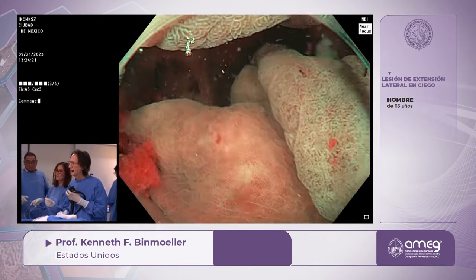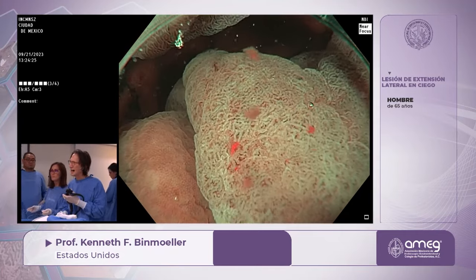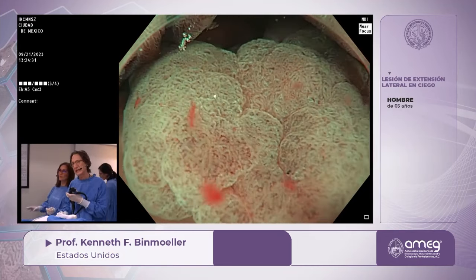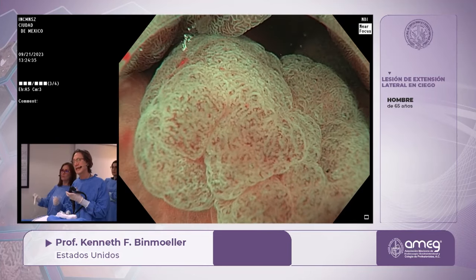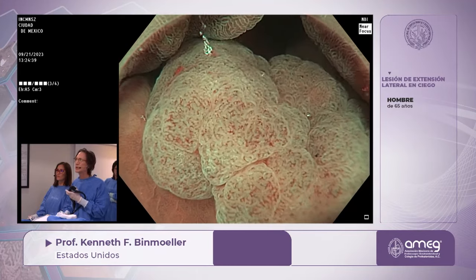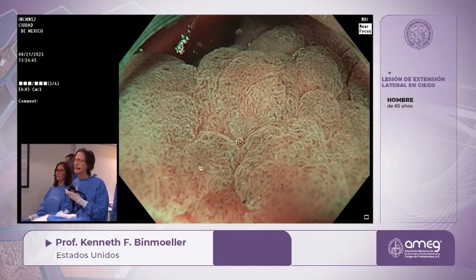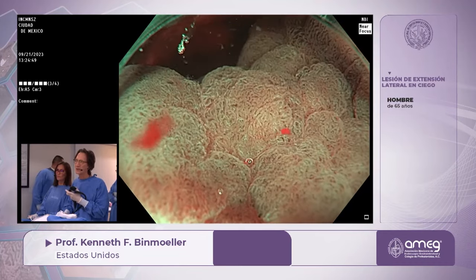Oh, freeze the image? What's the button? Just freeze the image. Well, there's branching, okay? You can see the branching, and this is a Kudo type 4. So if you see branching, that tells you there's definitely dysplasia, probably high-grade dysplasia in this lesion. So I would call this a Kudo 4. The NICE type would be 2, because I don't see any irregular vessels. I don't see any fallout of vessels, distorted vessels.